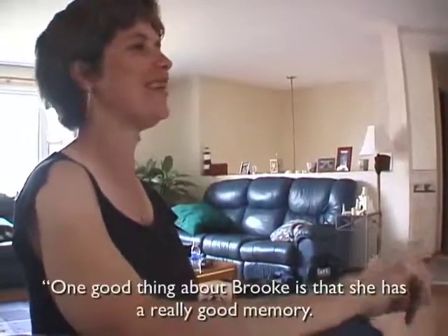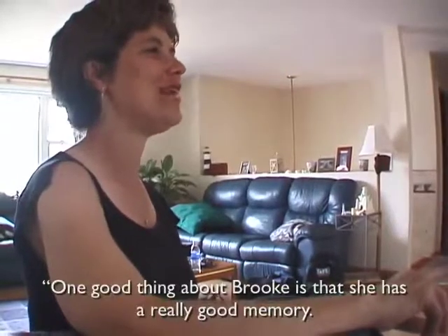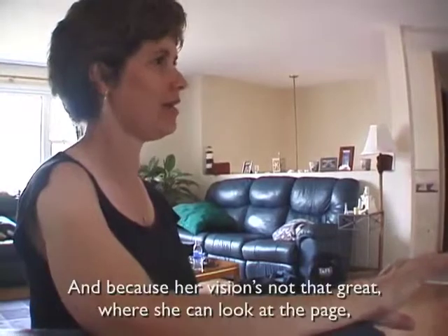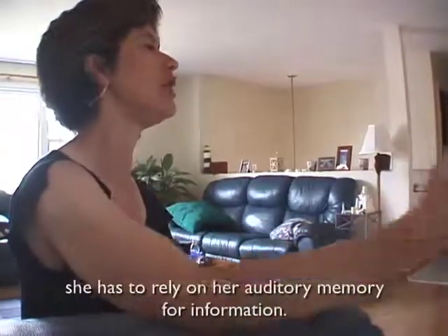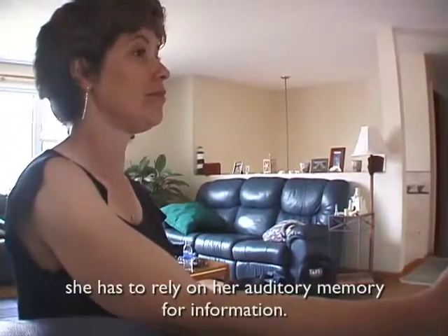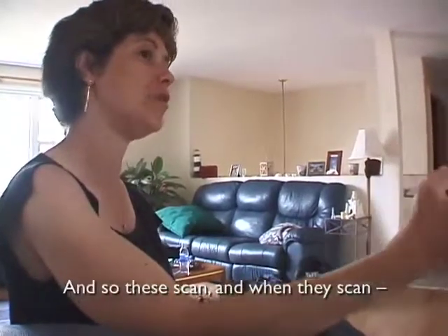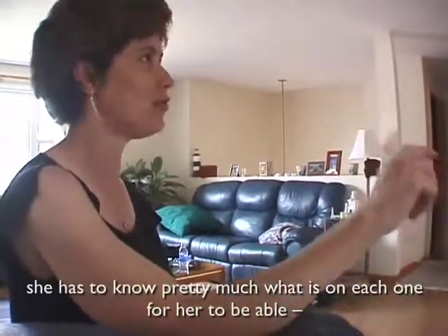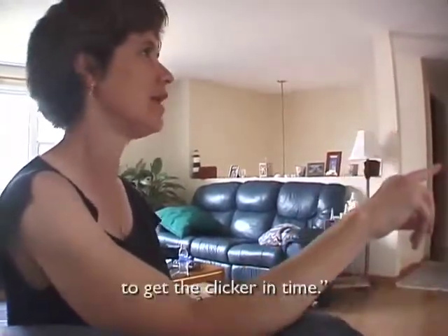One good thing about Brooke is that she has a really good memory. And because her vision's not that great, where she can look at the page, she has to rely on her auditory memory for information. And so these scan, and when they scan, she has to know pretty much what's on each line for her to be able to get to the clicker in time.